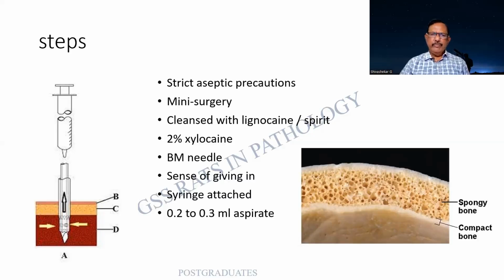Obviously, it will be. Let us make use of this picture. Look at the innovation nowadays. It is a bone marrow biopsy that is being done, and this is used for the cutting and the biopsy. Simultaneously, there are some pores, or holes, outside the needle, and it is literally a double barrel. So the marrow aspirate goes in by means of these adjoining pores, whereas the biopsy that you are cutting and taking comes into this needle. So it is a two-in-one technique. We shall be dealing with these techniques later on.